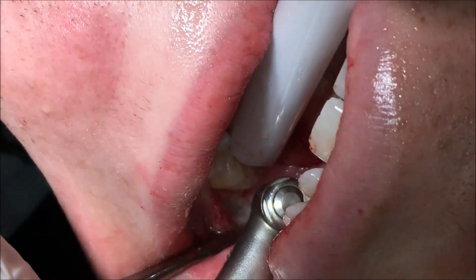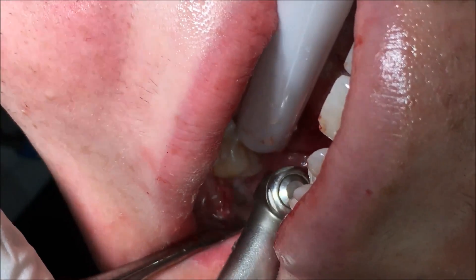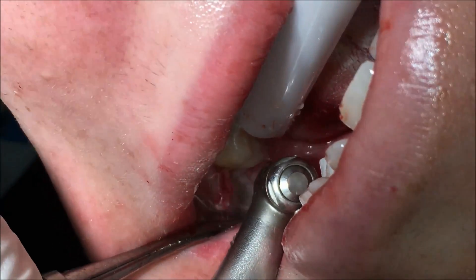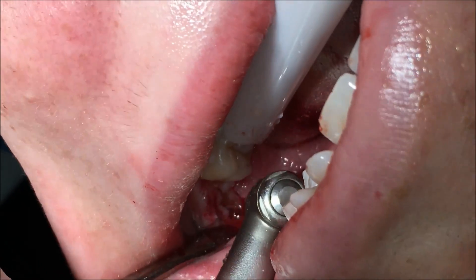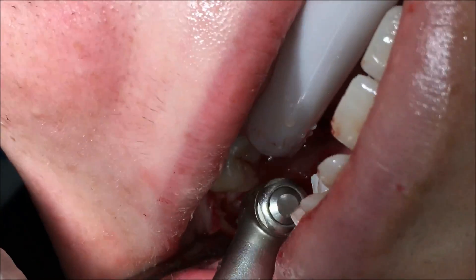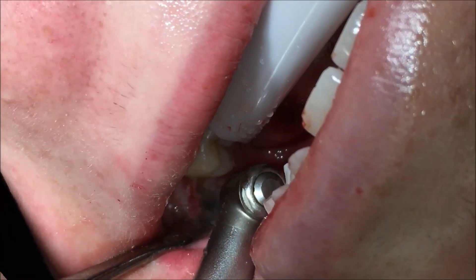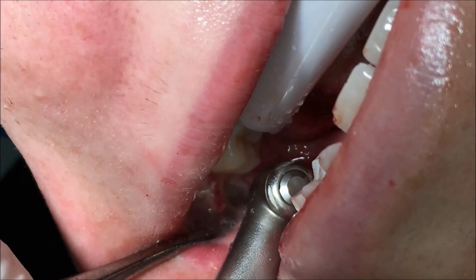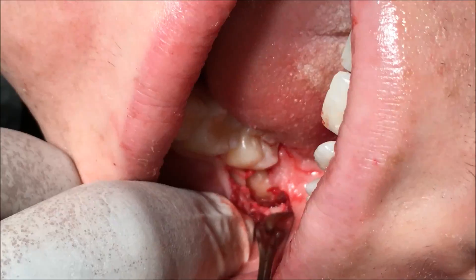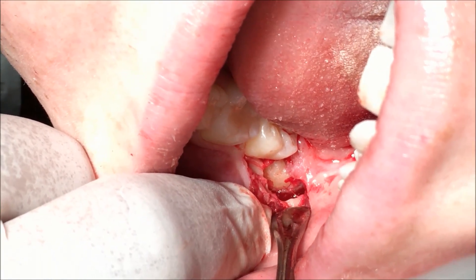Because of the lingual inclination of this tooth, once we remove this amount of bone, we'll be able to see the buccal surface of the tooth quite clearly. The reason I go for a little bit more bone removal on the buccal is so I don't have to do as much on the lingual and hopefully be able to deliver this tooth through the buccal. The bone removal goes all the way around to the distal, so you have to get rid of all that distal bone, especially when you've got two separate roots like this. You can see the buccal gutter there and it extends all the way around to the distal.